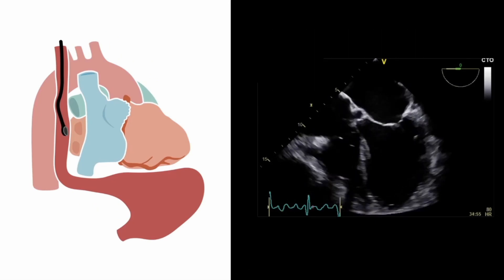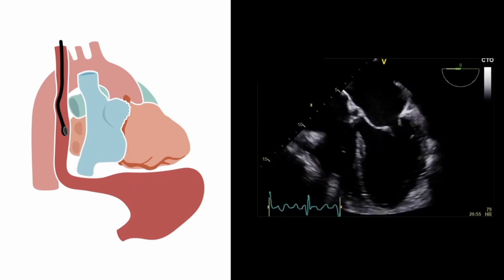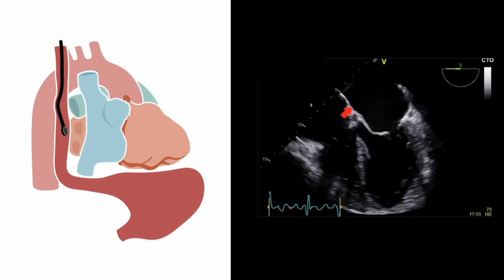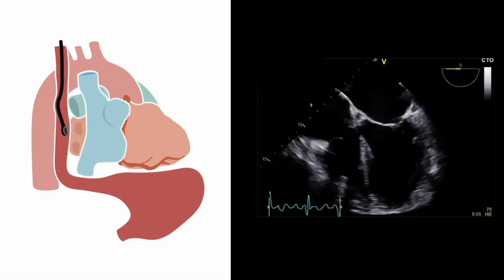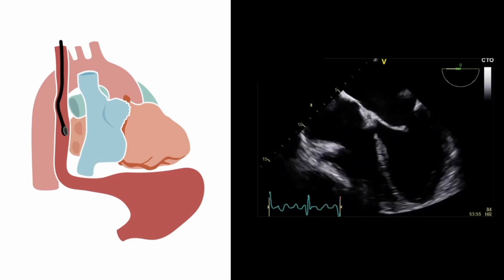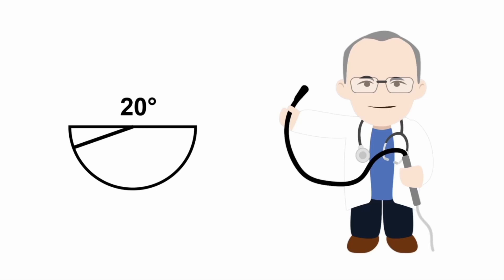Here's the image we've now obtained by retroflexing the tip of the probe and advancing it a little, and we can see that it is better. We've eliminated a large proportion of the left ventricular outflow tract and aortic root, but there's still a little bit visible. So there is one further adjustment we can make: we can rotate the imaging plane forwards a little to increase the imaging plane angle to about 10 or 20 degrees.